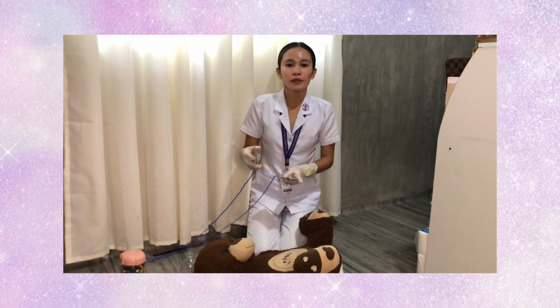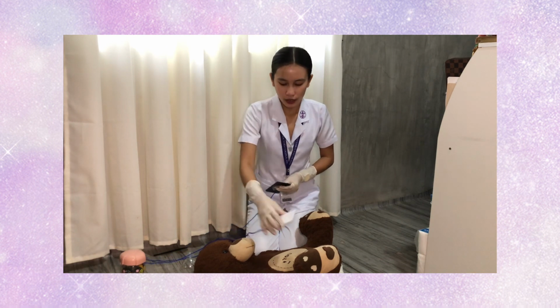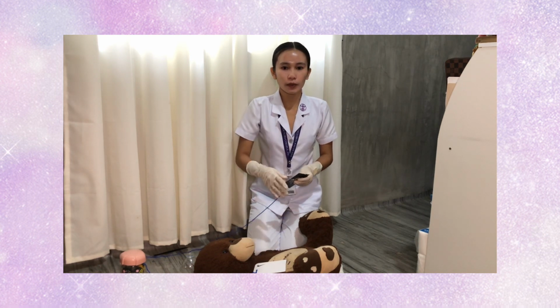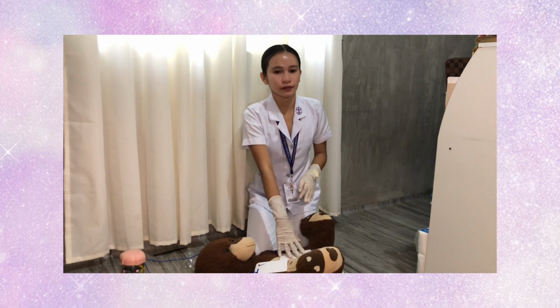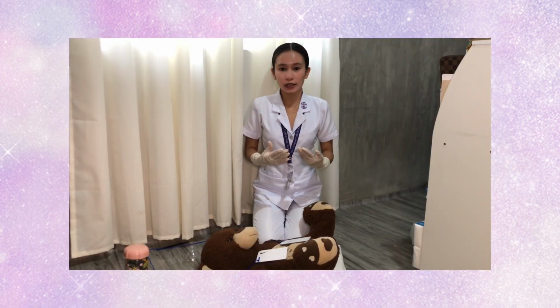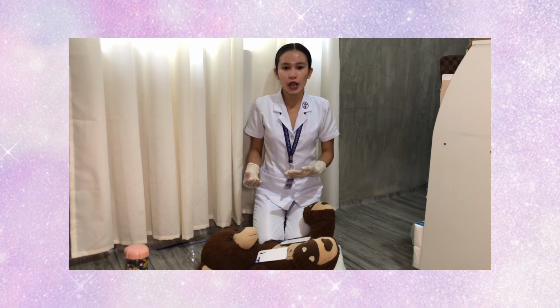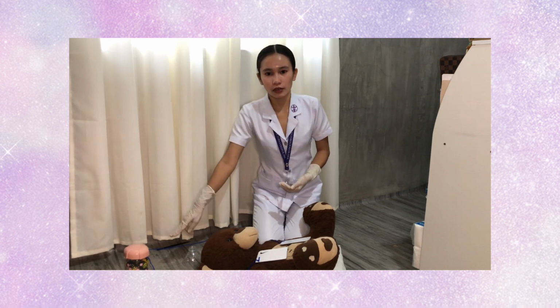One goes over the upper right area of the chest, below the clavicle, and the other one will be placed beneath the armpit, just below the nipple line. So the AED is still analyzing. After a while, it will tell us to stay away from the patient and not touch the patient because it will deliver an electric shock. While that happens, we are going to clear and deliver the shock in 3, 2, 1, shock delivered.